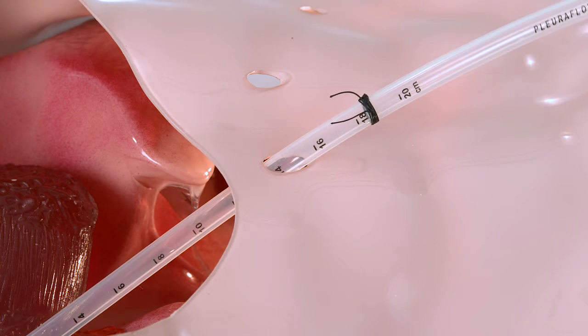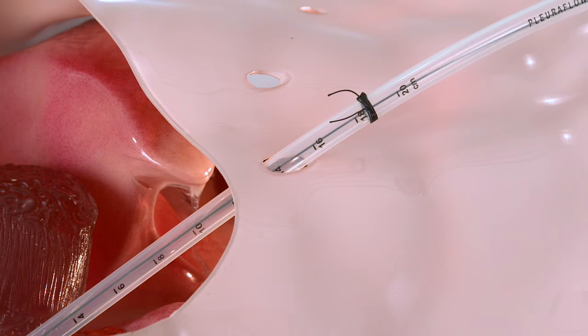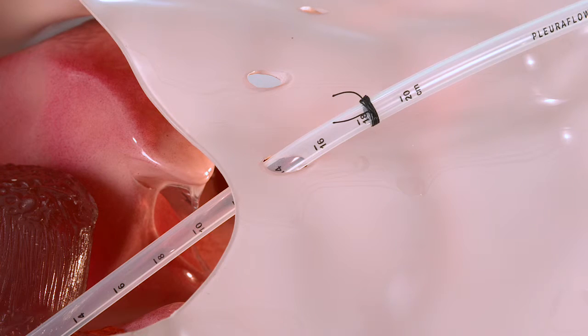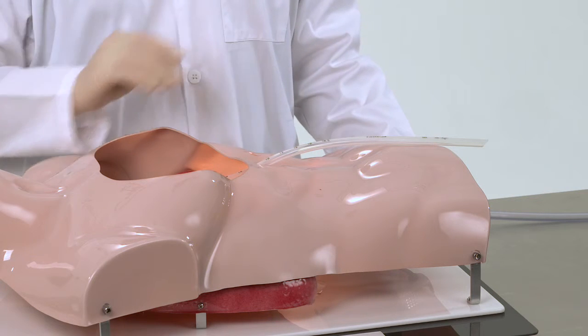Once the tube is secured, test it once in the operating room to make sure the clearance loop glides past the suture line while the patient is still on the operating table. If this is preventing the clearance loop from advancing, it will have to be retied to allow the clearance loop to freely pass as intended.